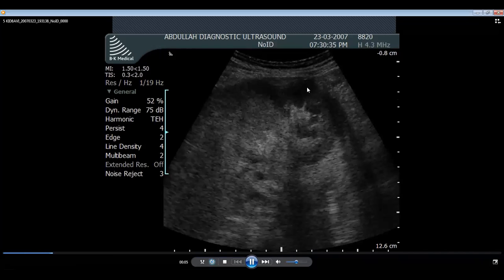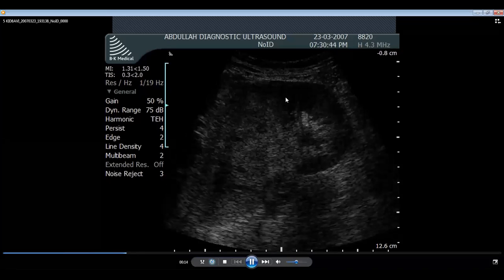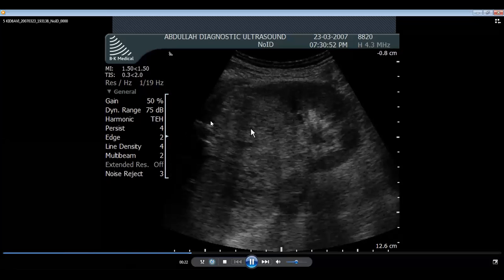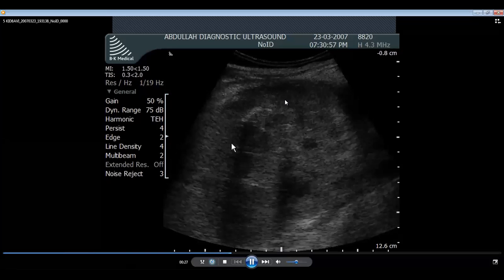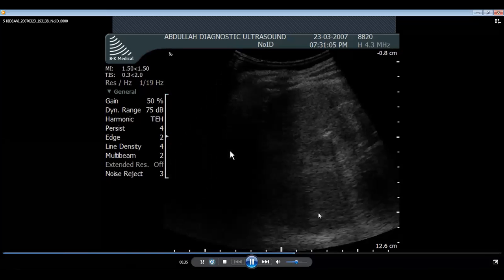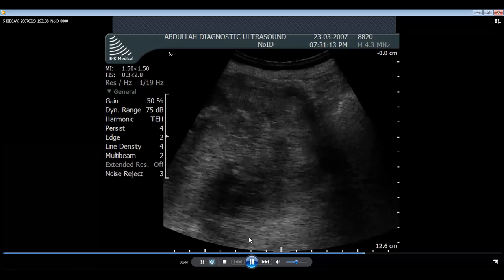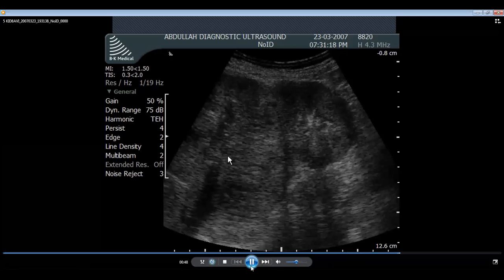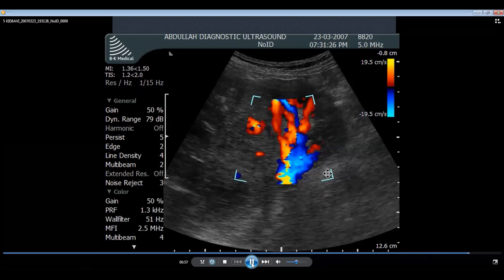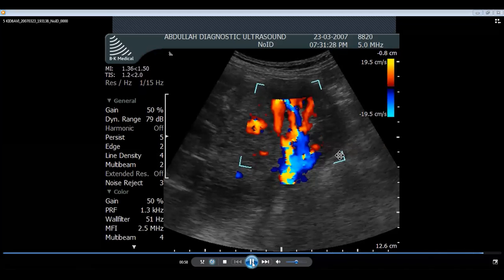Kidney, renal parenchyma here is all right, but when we go up, you can see it's all distorted. This dark gray parenchyma is distorted here because of this fleshy growth, a huge fleshy growth in the upper pole. This is how a renal tumor will appear, a huge renal tumor in the upper pole. And many a time you will see them growing silently. Most of my trainees have diagnosed this condition when the tumors were growing absolutely silently. So there you see the lower pole of the kidney is supplied by the renal vessels, but here this is the tumorous upper pole. Right.